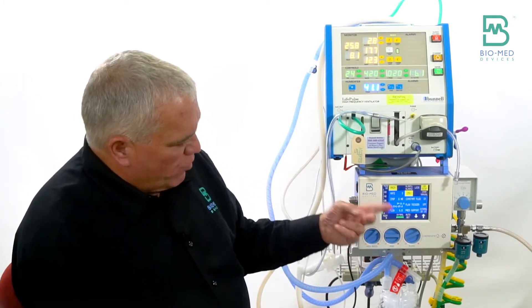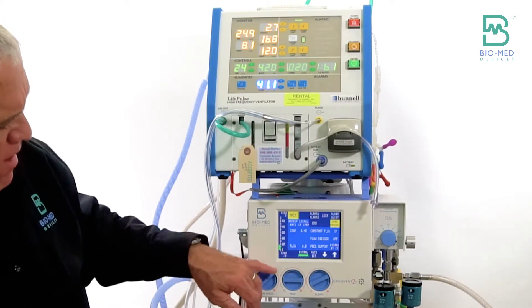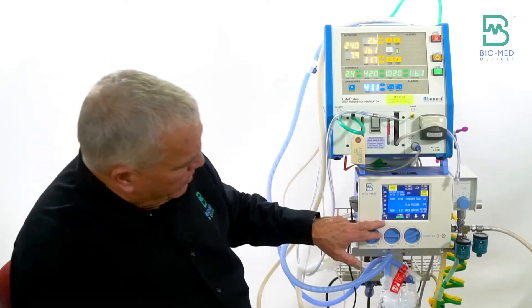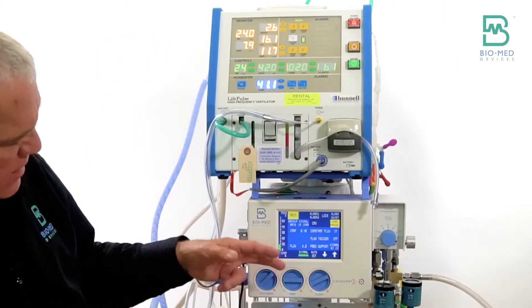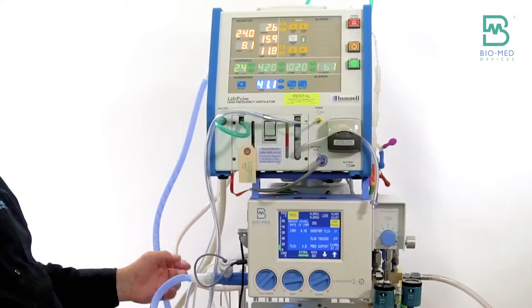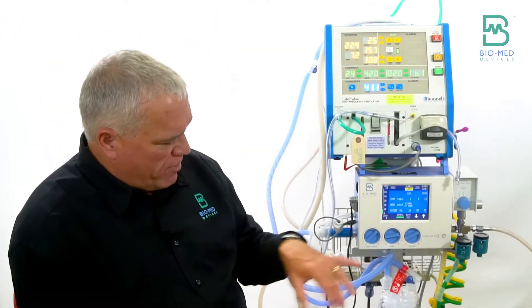The bar graph does show PEEP correctly as soon as you're reconnected — you just have to wait for that second breath for the numeric display. If you're going to have the baby in CPAP, all you have to do is switch it to CPAP mode. In CPAP, the PEEP number is constantly changing — you might see seven, eight, nine, ten — so don't rely on that number. Focus on the bar graph and adjust accordingly. If you get a disconnect in CPAP, the alarm clears immediately when you reconnect.